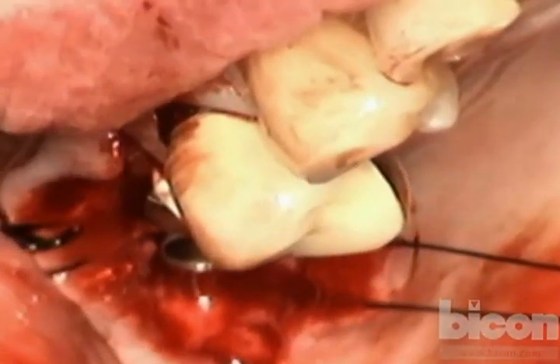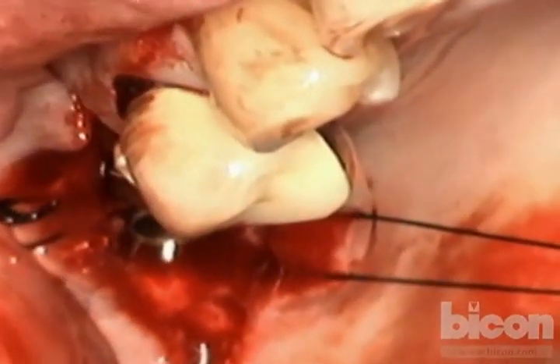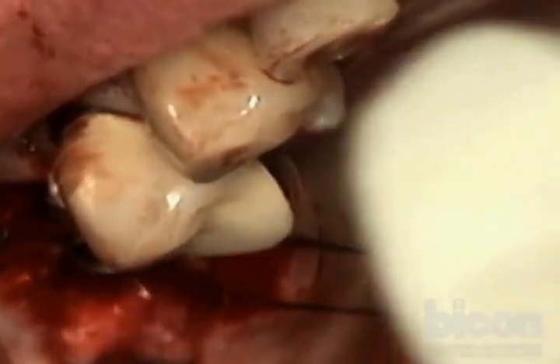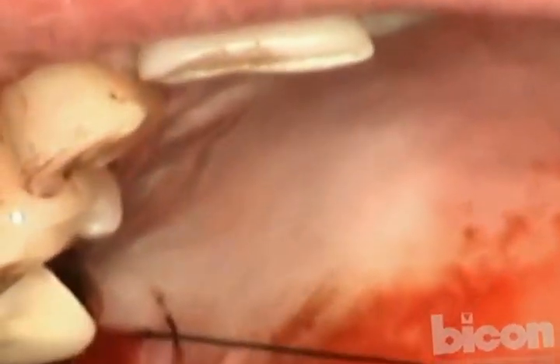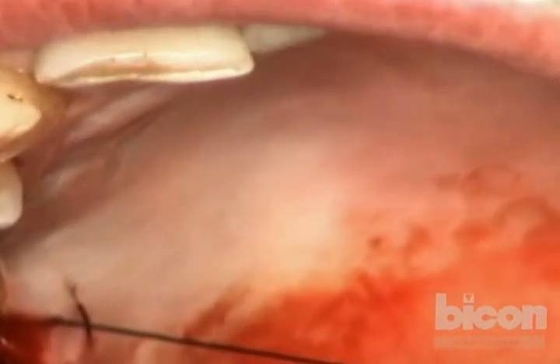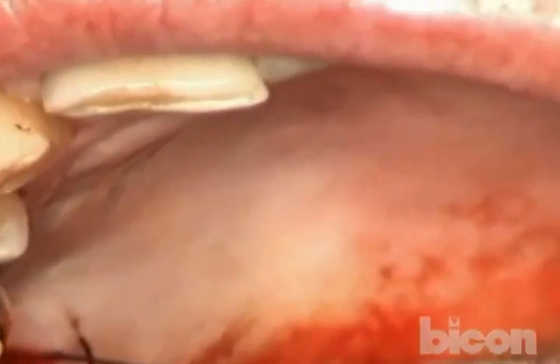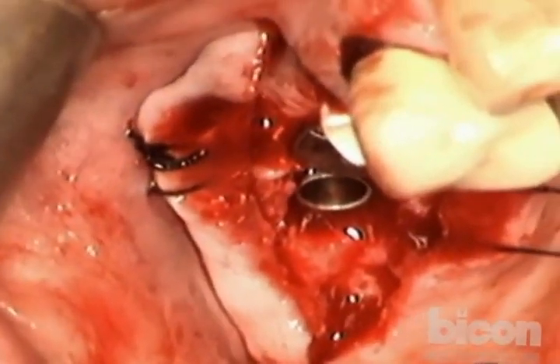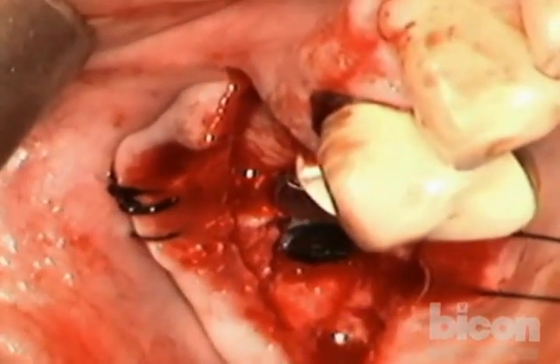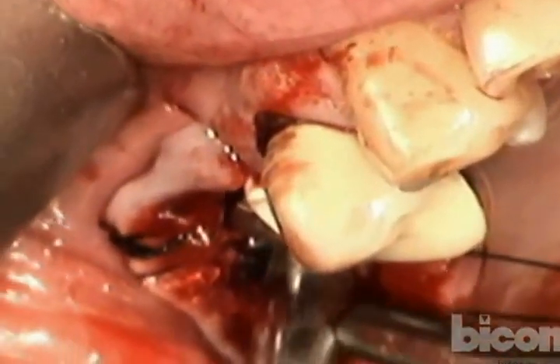So in this case, I will just go ahead and place the healing plug, because there was enough thickness at the distal end to give us stability. And that way I will keep enough bone over the implants to create a nice crest. And for that, I just cut the black healing plug outside the mouth. And I will just turn slightly to the left. There you go. And we'll go ahead and place it in there. And as you can see, it's pretty solid. Okay. So we took advantage of all of the anatomical changes.